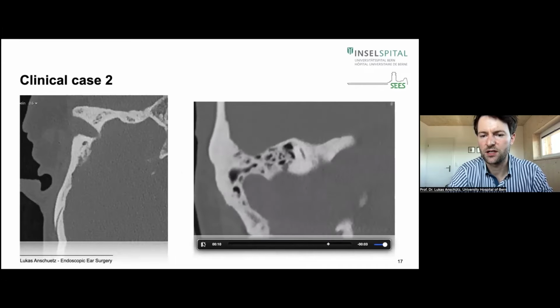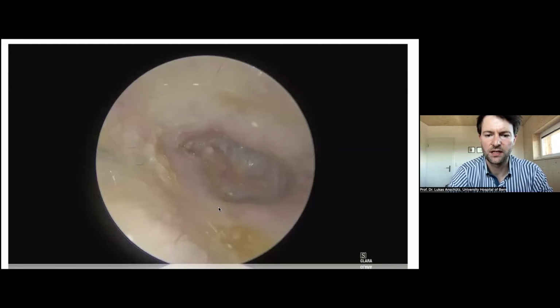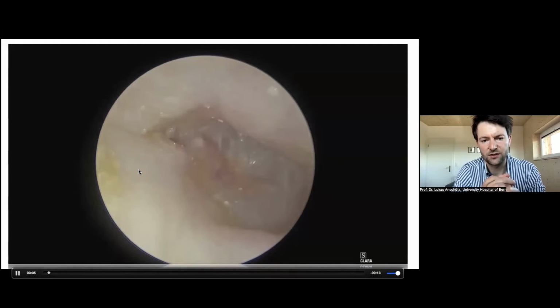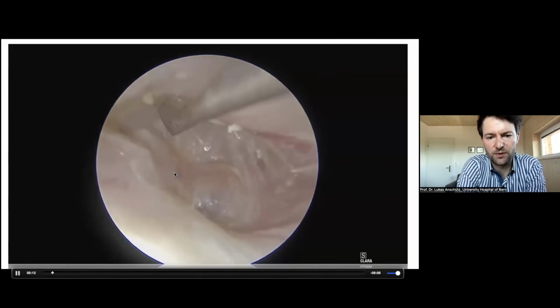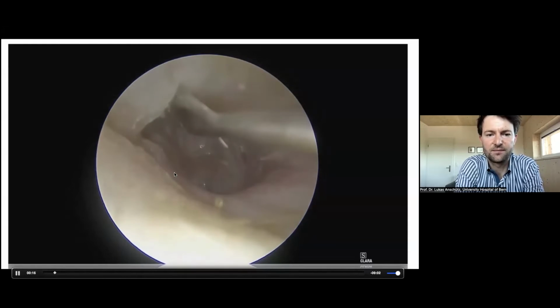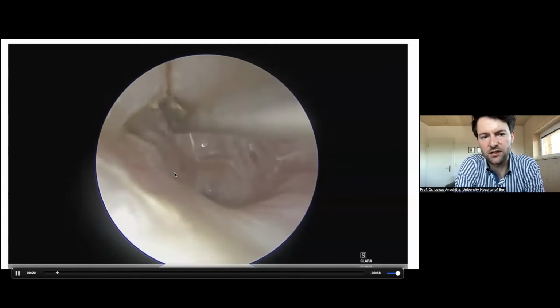Okay, so I scheduled the patient, as I said before, for the same kind of surgery. We can now see it here. Again, the infiltration, a little bit of adrenaline, and you see how it gets white very nicely, and you have a nice vasoconstriction to have not so much bleeding. Now I ran out of my monopolar needles, and you can see you can also do it without. It's not a big deal.